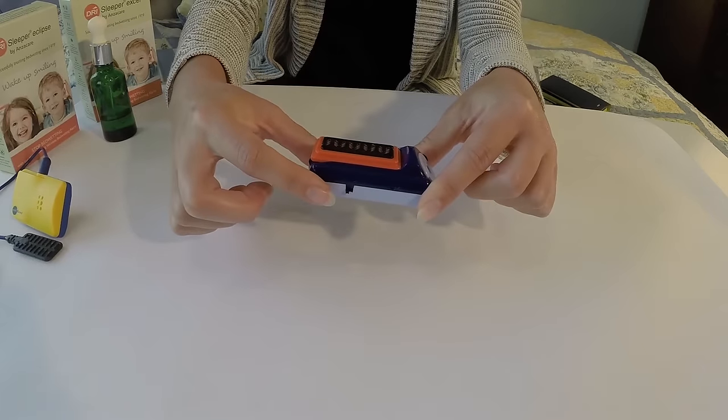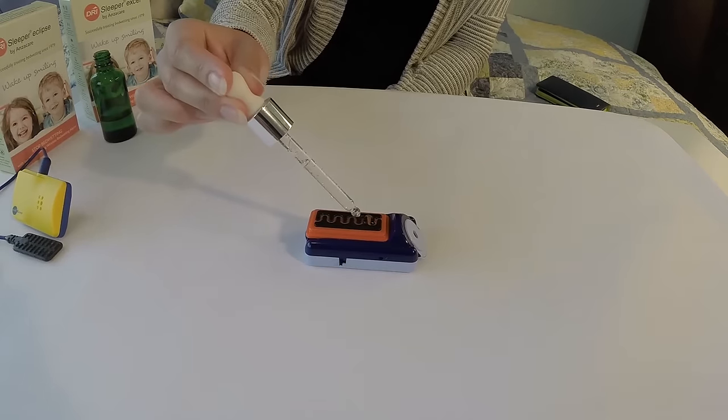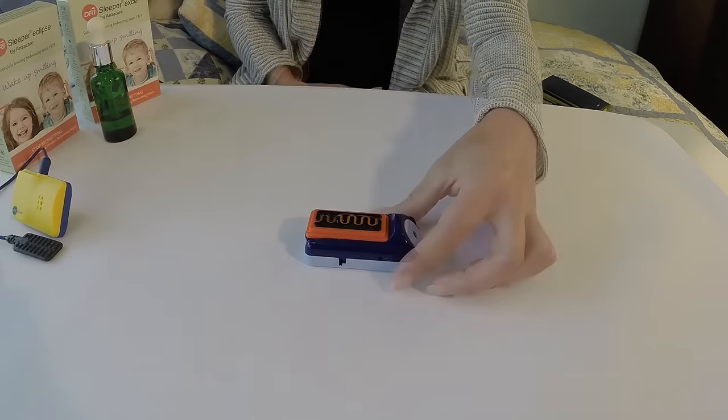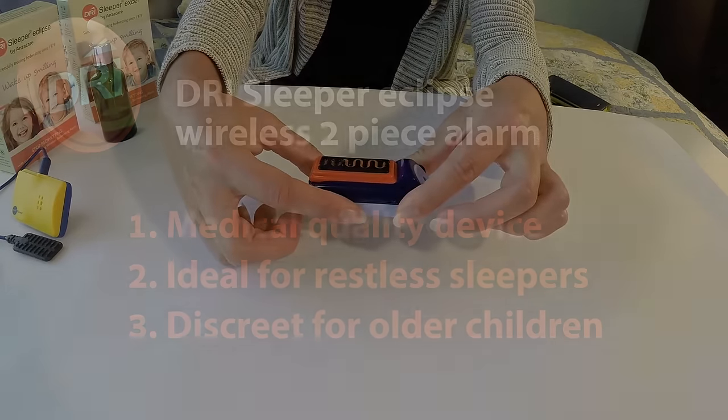To use the alarm, turn it on. Then when the sensor detects moisture, the alarm will trigger. To stop the alarm, simply turn it off.